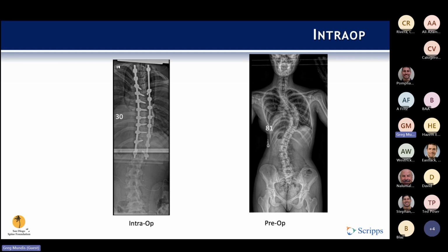delivered to us via UNiD, and I was actually really happy that we did it because, instead of me bending the rod, these rods were created with the bend in them. So the rods that are delivered to you have never been bent, and I think there may be a strength component to that that is very beneficial. It definitely wasn't her. So I had them actually send us 2 of the concave rods and 1 convex rod. The concave rods, I actually had to switch out.